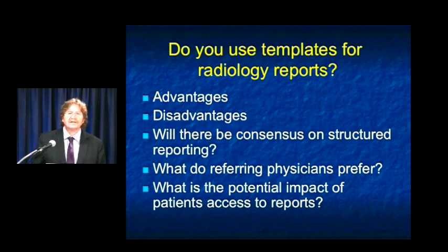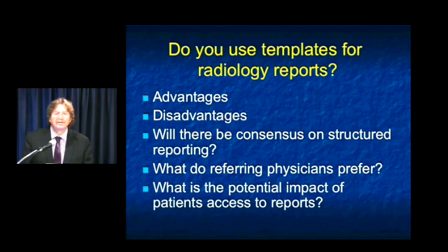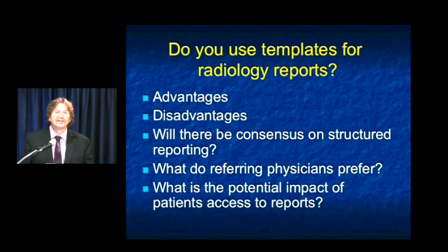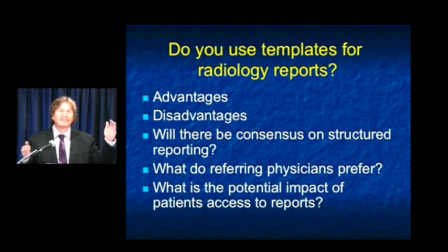The last thing let me touch on, since we're talking about practice guidelines, is in your practice when you report CT, are you using templates? Templates are something the ACR is pushing. Some people love templates. Probably your residents use templates. There are advantages and there are disadvantages about structured reporting. There are articles that say referring physicians prefer them. Then there are articles that say referring physicians hate them because the report becomes so long, they want to know what the bottom line is.